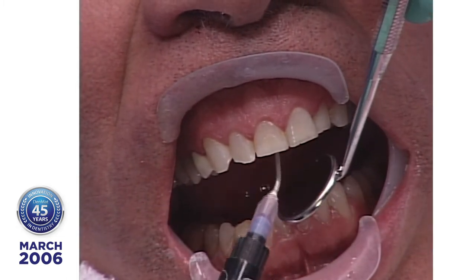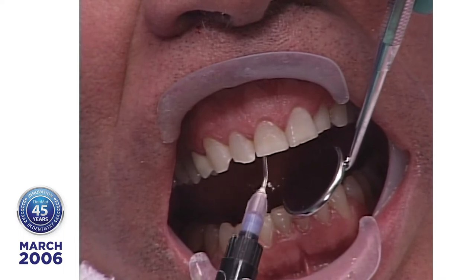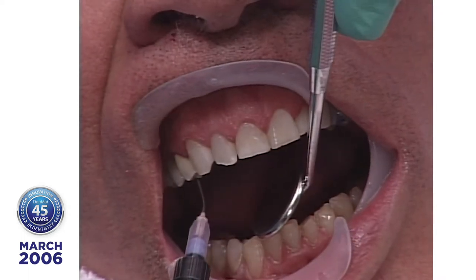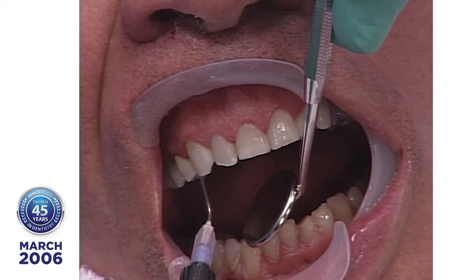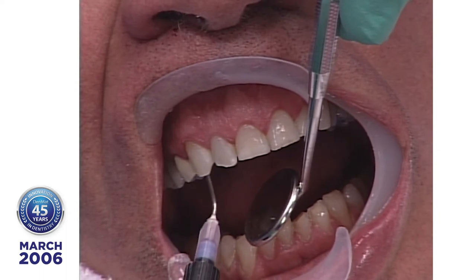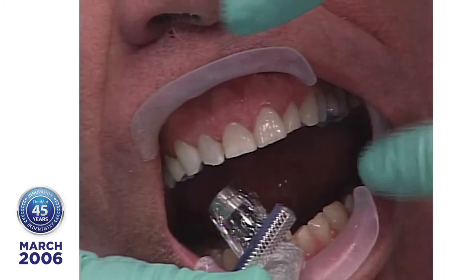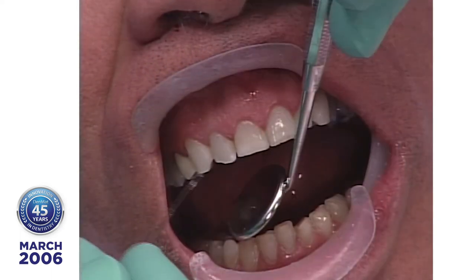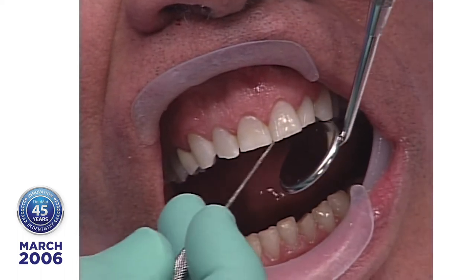And by being about an inch from the surface and giving it a 3-second exposure, I cure the paint on dental dam to a rubbery state. And as I said, once you prepare the surface, the Lumineer doesn't know what kind of a surface it's being bonded to. Let's go in a second. Close your eyes, everybody. Best way to protect your eyes is to close them. So I feel, make sure that it's not still running.